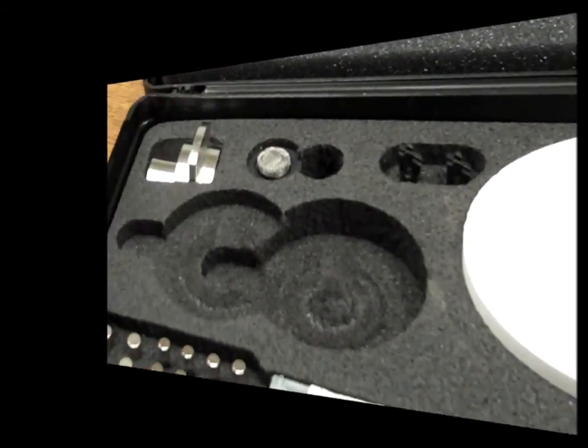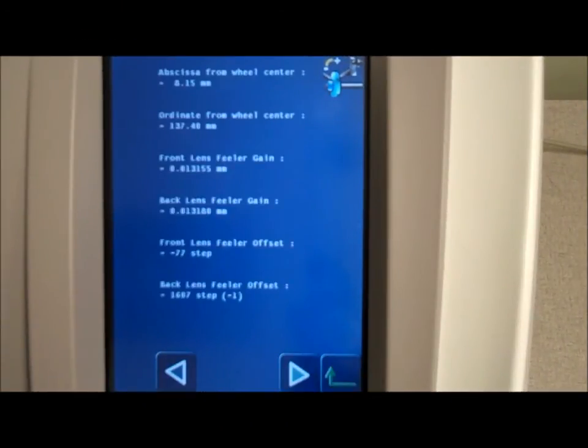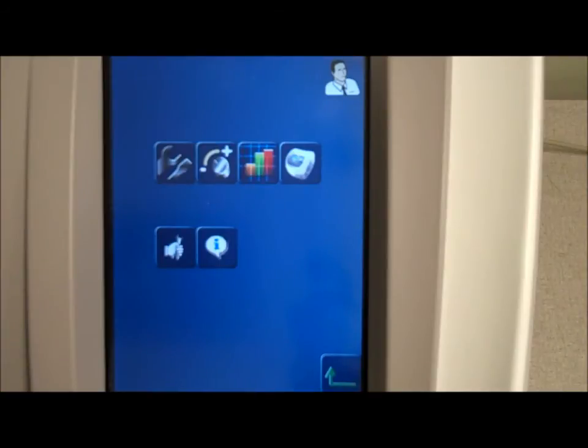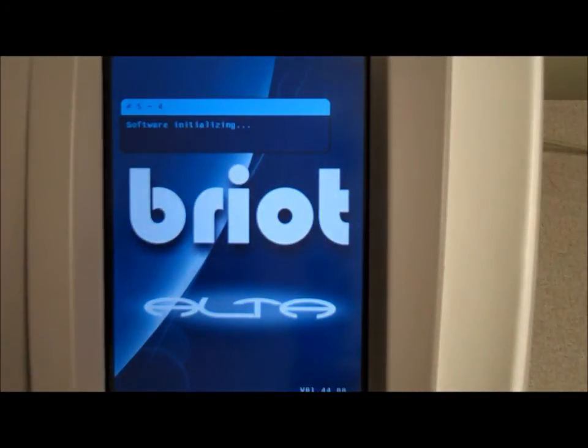Exit the calibration menu by selecting the Enter key until the Brio Alta home page is displayed. When the sequence is complete, the edger will return to normal operating mode.